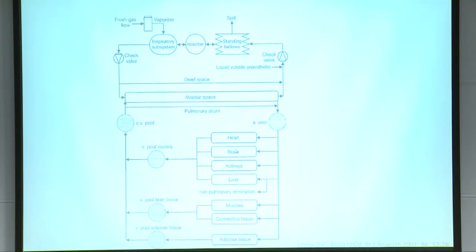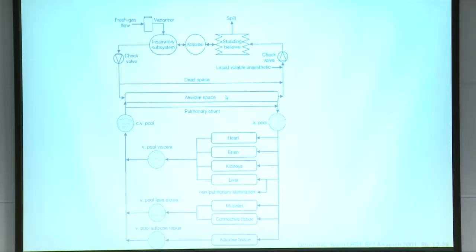So wouldn't it be nice in the future if this model were running in the background, as Professor Ikeda used in Hamamatsu, where you measure end-tidal concentration of the agent, put that into the model, have a non-invasive measure of cardiac output. We measure end-tidal CO2 to compensate for cerebral blood flow changes that happen at different CO2 levels. We would then get quite a reliable measure of brain concentration, and we could display that in our anesthesia machines.